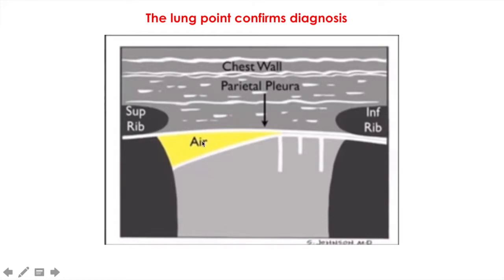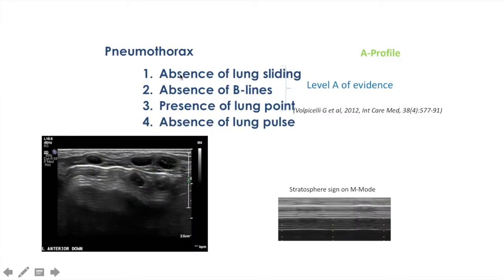All you can see here will be air. So you will have A lines. But as there is no lung parenchyma, you cannot see any B line, and this is extremely rare in the neonatal lung. As a consequence, the main 3 criteria you need to remember today for diagnosing pneumothorax are absence of lung sliding, absence of B lines, presence of A lines only, and presence of a lung point.